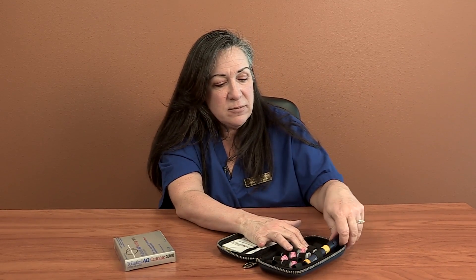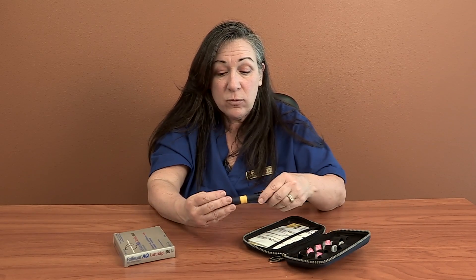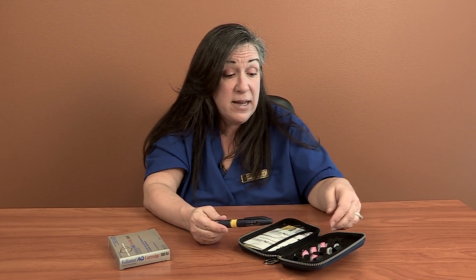Follistim comes basically in one way — in what's called a pen. You're going to be delivered this little zipper case, and it's actually got in it just the pen. There's no medicine here; it's just the pen and a bunch of little needles that go on the pen.